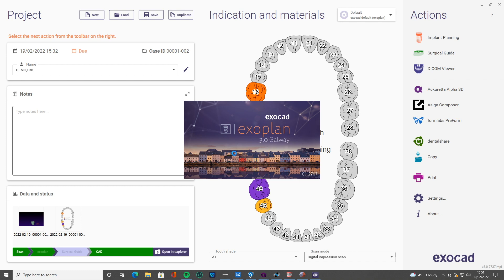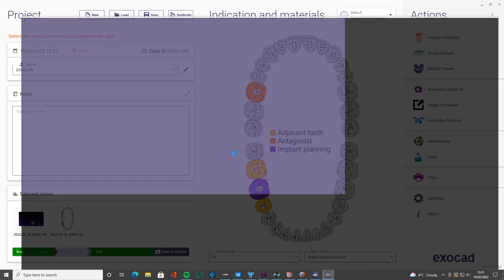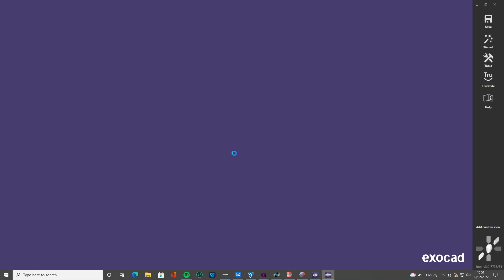Obviously we've done that, we've set everything up. I'm going to click surgical guide to click the next step, so it's going to bring everything in exactly where we left off in Exoplan.